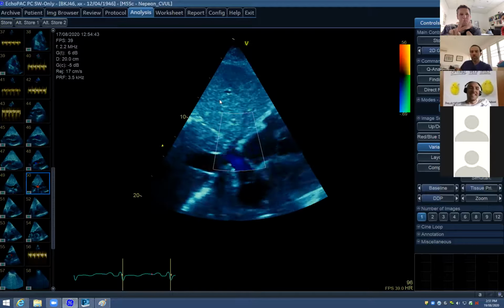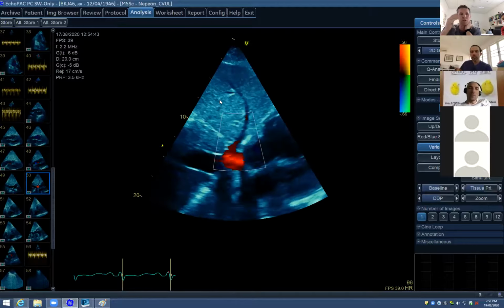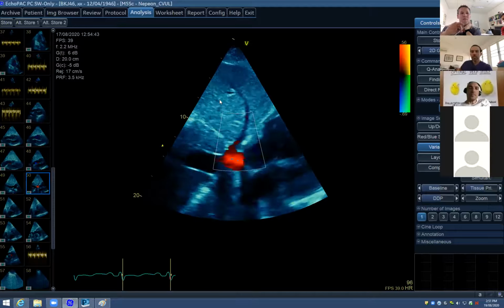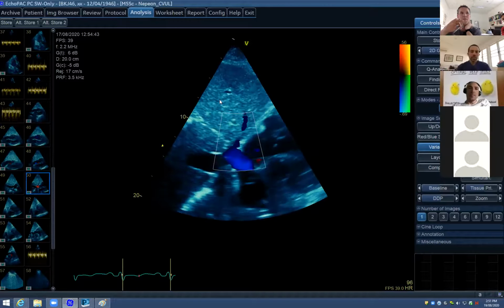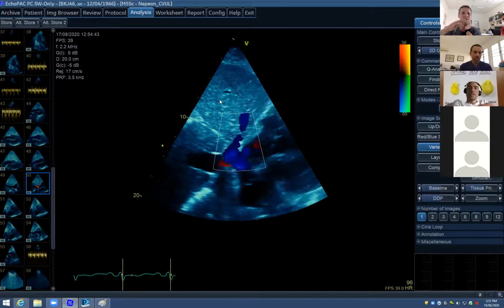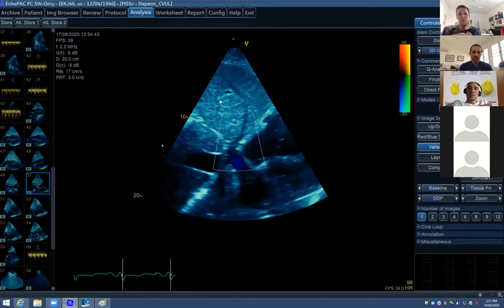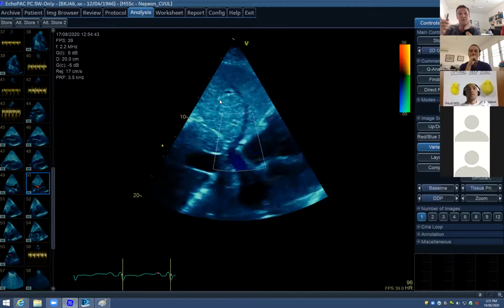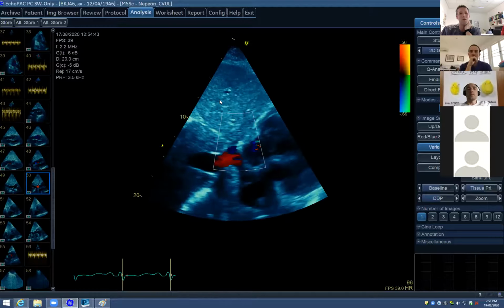Because I think it's almost like a physiological diagnosis as well as an echo diagnosis. You've got to have all those features you described on echo, but also signs of the RV failing. An RV failing is where the RV can no longer generate forward flow, so you've got signs of systemic congestion. That's the big thing for me. This is the contentious bit, because there are papers that say that systemic congestion is simply having a big dilated IVC. I would argue that it's more than that.